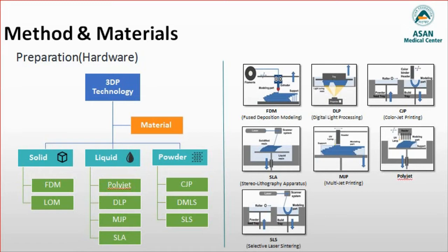In the finishing process, the prototype surface is infiltrated with a cyanoacrylate-based material to harden the structure. Because it uses CMYK color ink cartridges as used in conventional 2D printers, the 3D fabricated object can be printed with almost the same range of color.